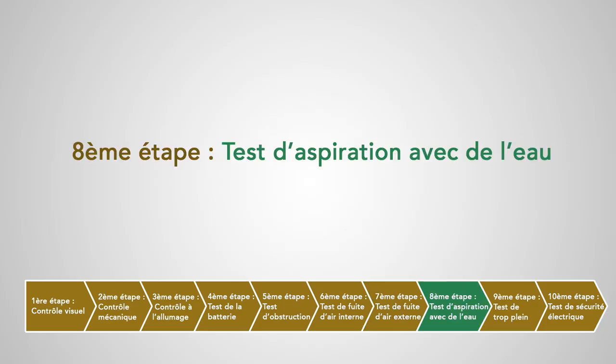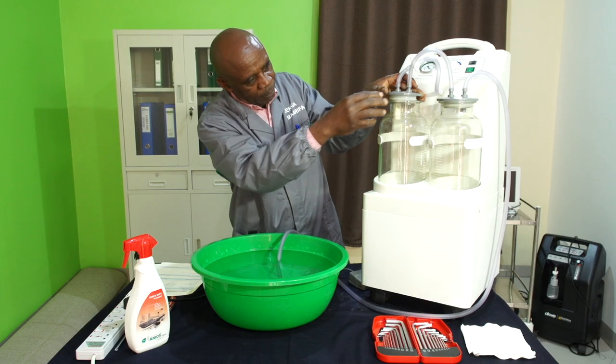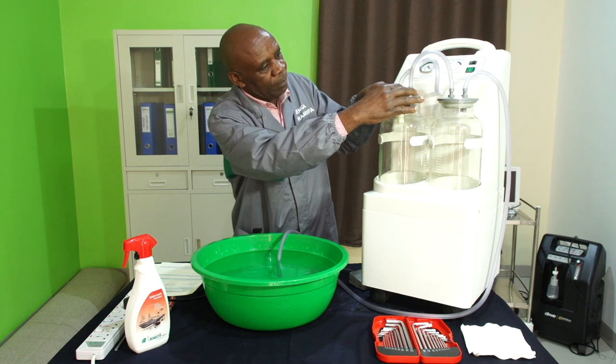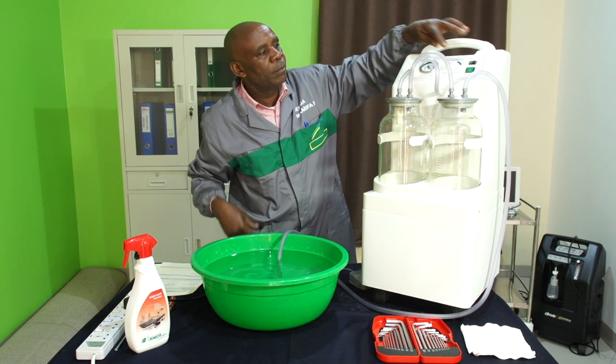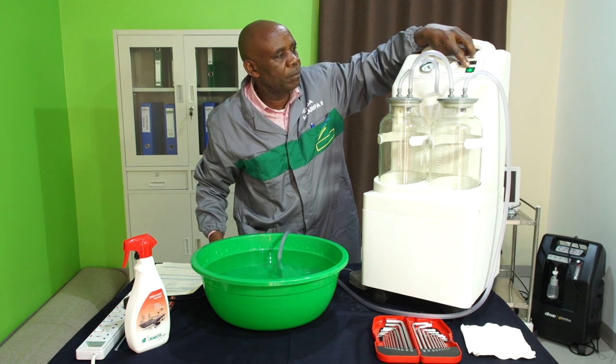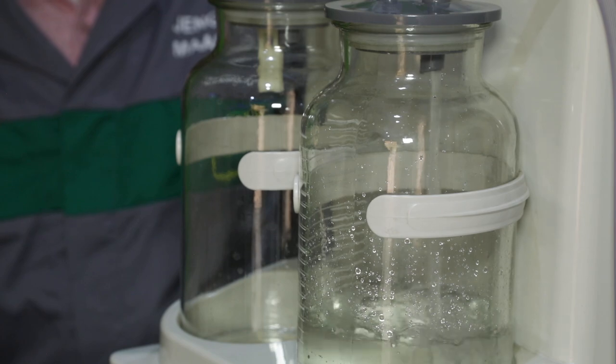Huitième étape : test d'aspiration avec de l'eau. On va vérifier que le flotteur est bien fixé au couvercle. On va allumer l'appareil et aspirer de l'eau à travers le tuyau patient, puis vérifier que le liquide coule dans le bocal.